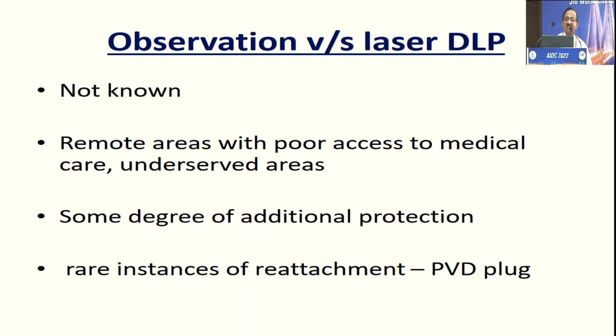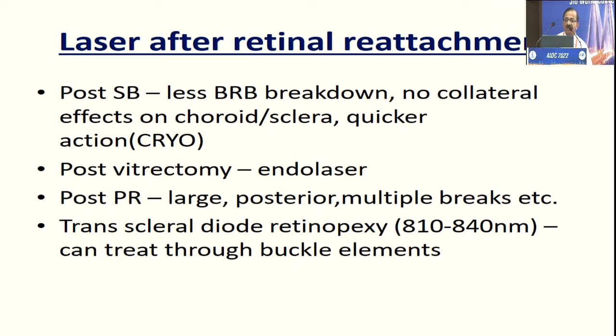Observation versus laser, the role is not proven really. In remote areas with poor access to medical care or underserved areas, some degree of additional protection may be afforded by laser in these situations. And rare instances of reattachment have also been described following laser, where the PVD that occurs post-laser, the vitreous itself plugs the break and the retina may attach. So those are some of the fortuitous cases, chance occurrences.